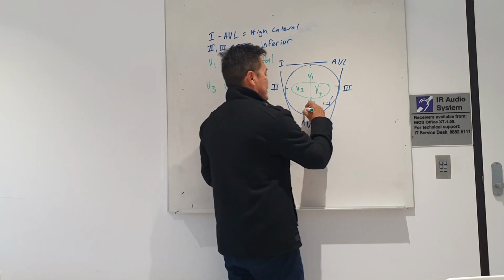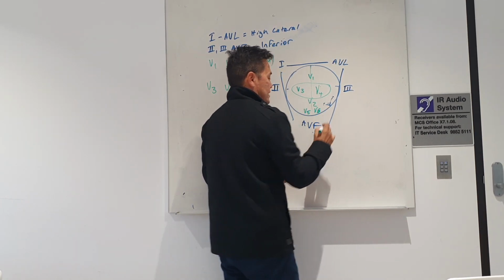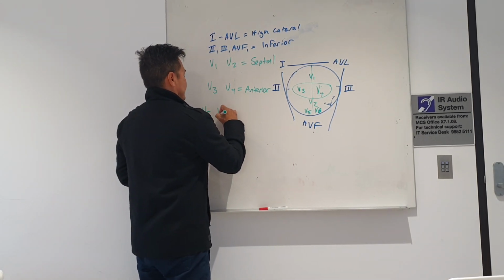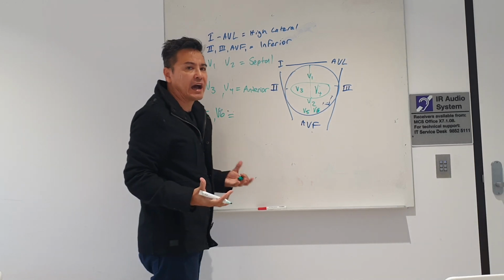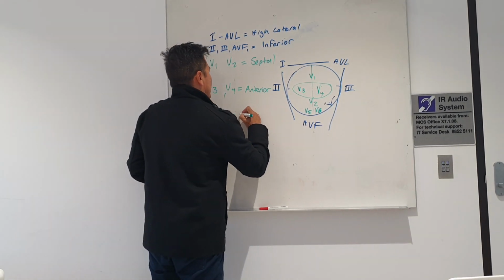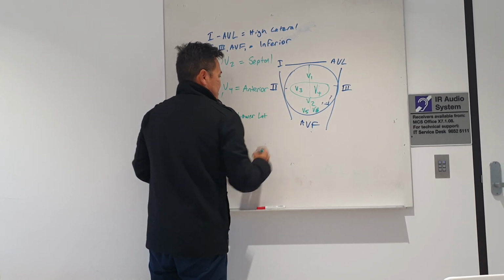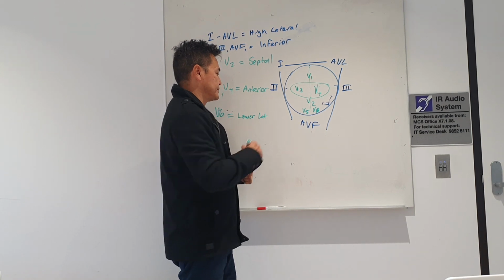And then we've got V5 and V6, and V5 and V6 are the lower lateral parts of your heart. So V5 and V6, right, that's a pretty chunky area of our heart, isn't it, right? So we don't want any damage done there as well, because that's kind of like the bulk of our muscle, our left ventricle, okay?